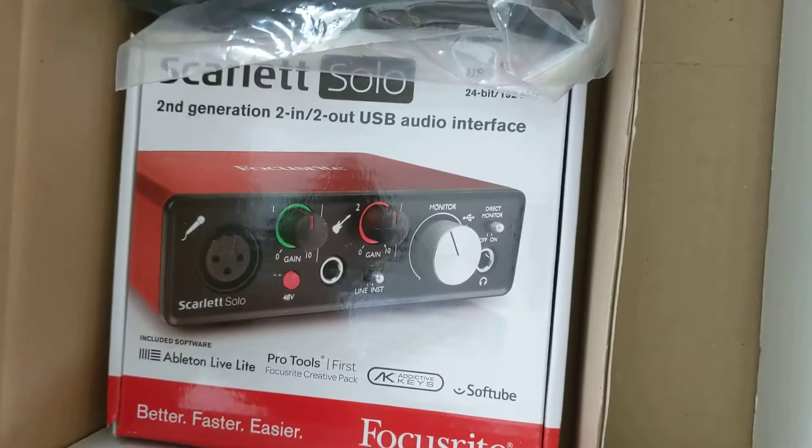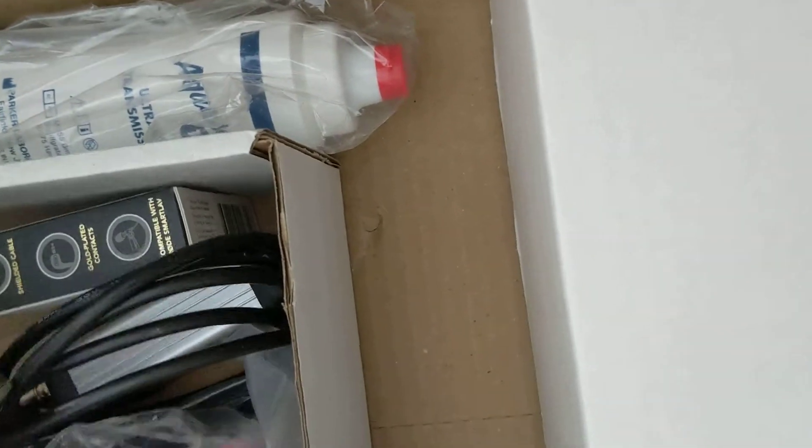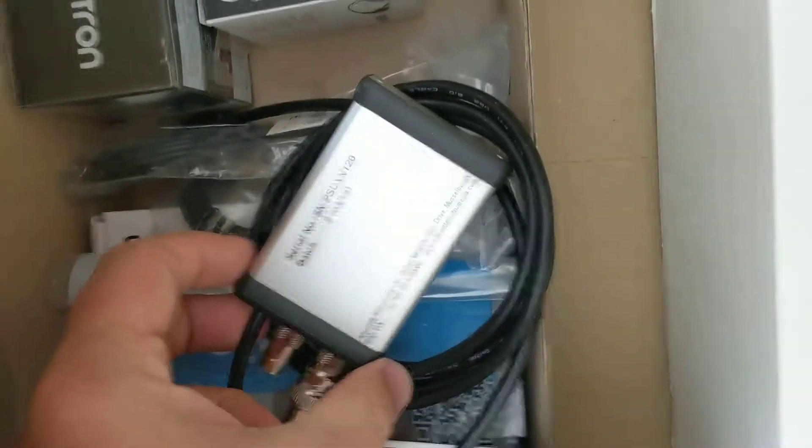Oh my, all kinds of complicated stuff here. We have a microphone, audio connecting units, a portable speaker, and the good old sync unit to make sure everything stays connected properly.